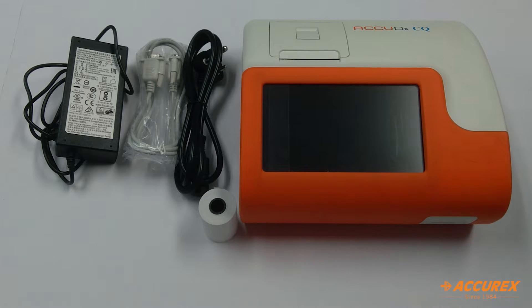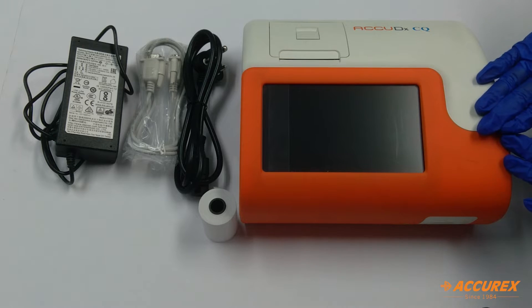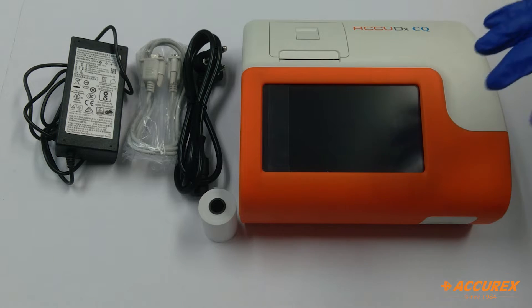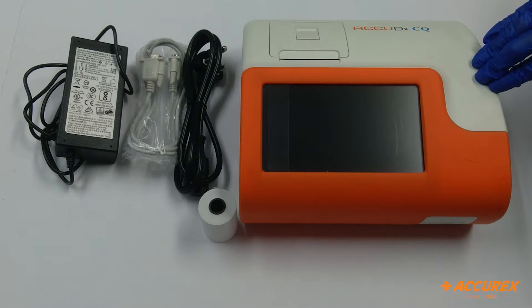Hi everyone, greetings of the day. Today we are going to see the Acurex CQ analyzer, which is an immunofluorescence quantitative analyzer. This analyzer is used for analysis of Acurex test kits for detecting heart-related issues, kidney-related issues, diabetes, fertility, metabolism, tumour, and thyroid.